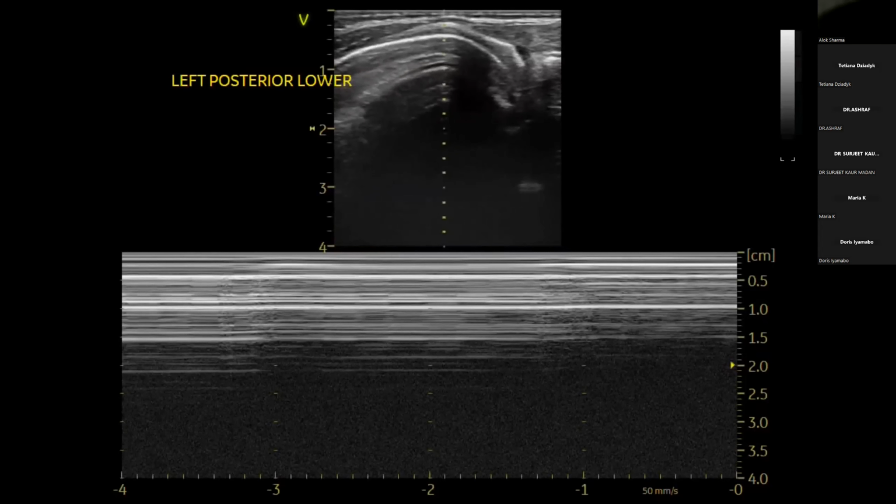Now, if I explain, it's a beautiful case to show everybody. So we're just going to give everybody 5 minutes, Dr. Ashraf, because this is such a beautiful case. I don't want to miss the teaching point. Should we look at all your slides? Yes, okay. So we'll go right from the beginning. It's a beautiful case.